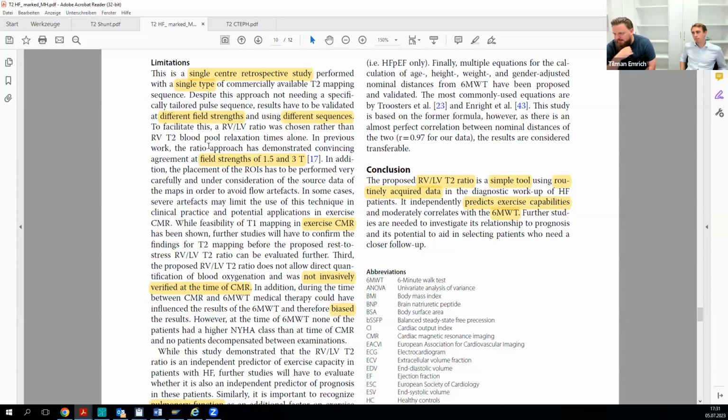And yeah, I think there are three things that we really want to do. First of all, we want to understand how accurate our sequence is compared to real life data, to invasive measurements, to show us the truth. Most likely we'll see that it's not perfect, but maybe good enough. And then number 2 and 3 would be, let's optimize the sequence in a way that it works as accurately as possible and still delivers the message.